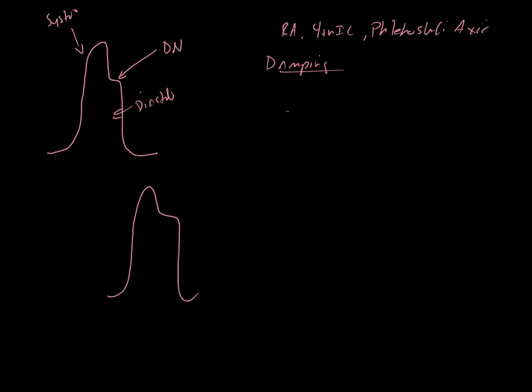Okay, so where does the balloon pump inflate? During diastole, so we typically use what? The dichrotic notch to differentiate when to inflate. So we inflate it on the dichrotic notch. You guys good with that? All right, so it would inflate here, and then when does it deflate? Yeah, so at the end of diastole before systole begins, all right? And so it'll look something like that.